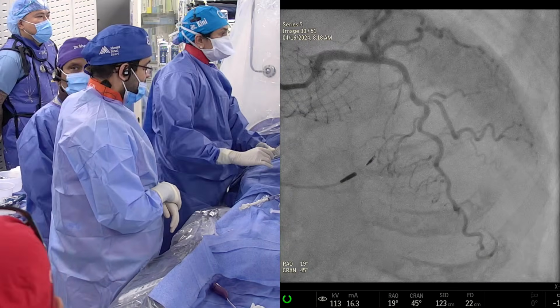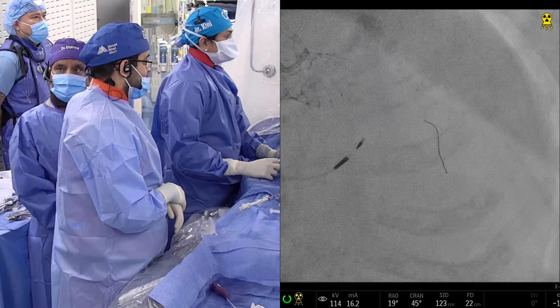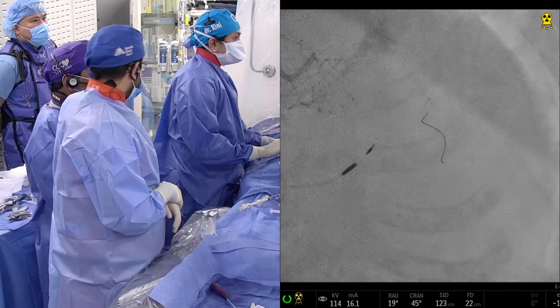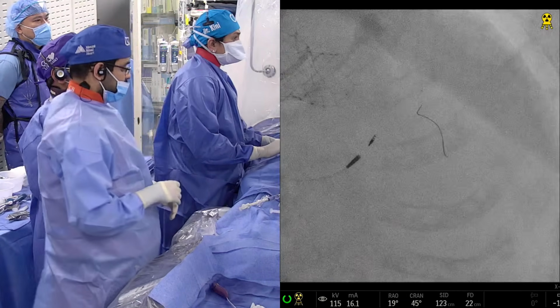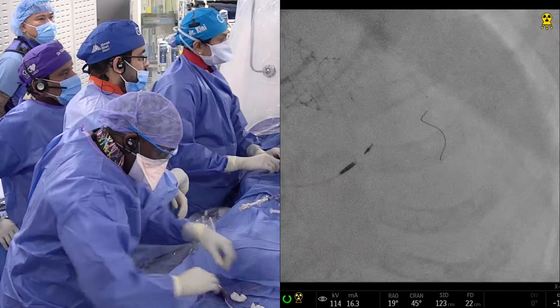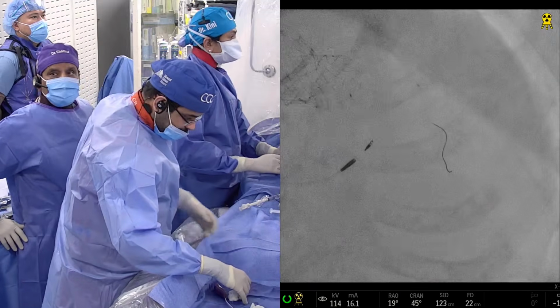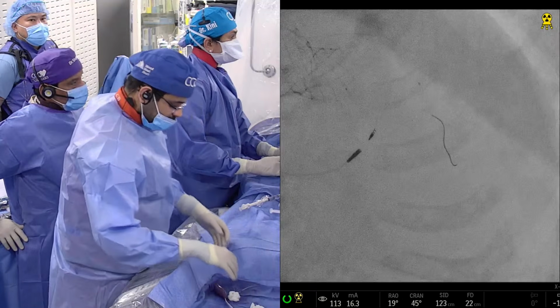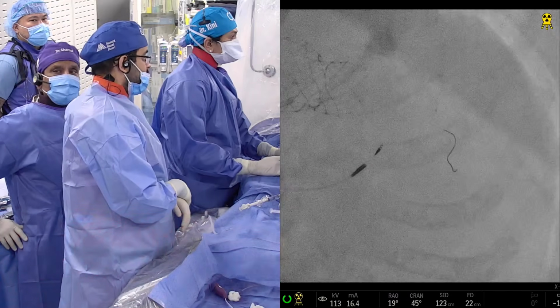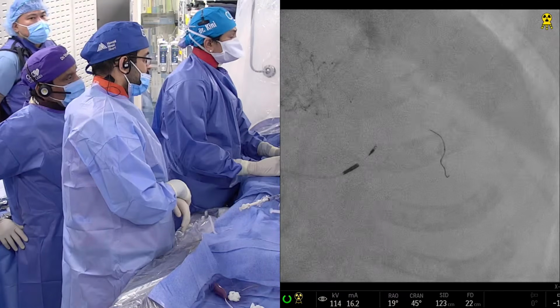After the diagonal, there looks to be a 30-40% lesion also, but we would just focus on that proximal LAD there, right? That's what I would say. In this particular patient, the only question that comes is that some people may say, do you need to do imaging, I mean physiological assessment particularly, in this case to really say that that is causing the trouble. But I think since the patient has a diagonal disease known in the angiogram of 2016, that's the first time when it was left alone.